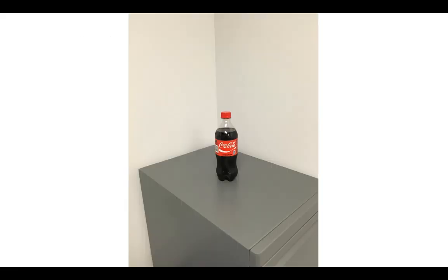So don't think of this as a bottle of Coke, but think of it as a DICOM object. Inside our DICOM object, the black liquid represents the image pixel data. I'm going to try some image pixel data right now. Ooh, image pixel data tastes good. The label on the outside represents the DICOM header file.